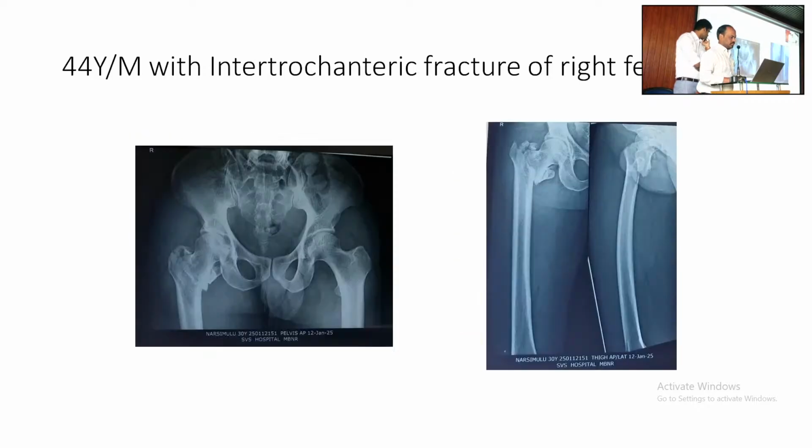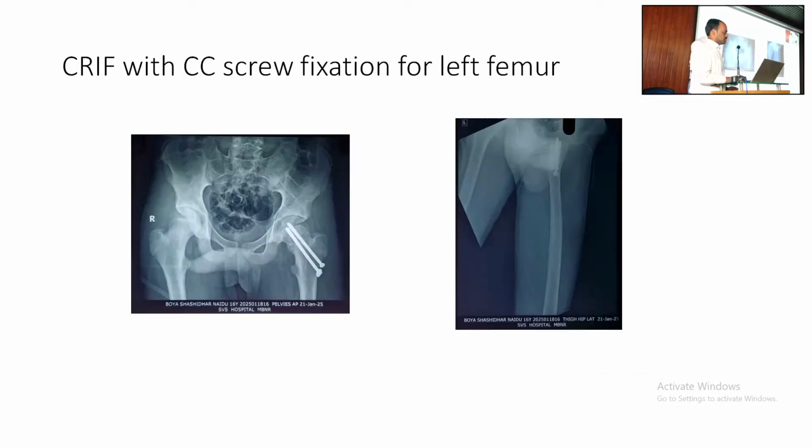And there is one more study of fully threaded screws. The moment the fracture has healed reasonably well, they should be removed. When do you want to remove this? The problem is this: you do a surgery, leave it there, and it becomes a broken implant. That's the problem. The best thing is, once it is healed, remove it. At follow-up they'll come in, no problem. I have two patients now where the implant is broken inside.